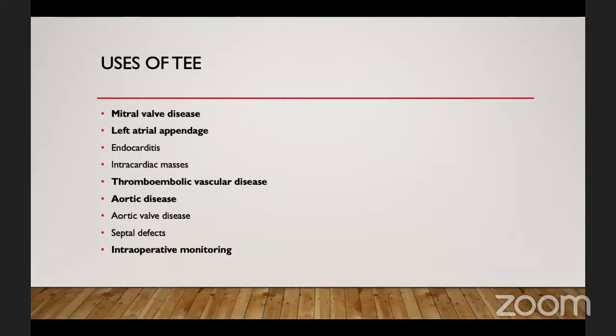Most of the time we use TEE, and an important thing for us as surgeons is that perioperative, intraoperative assessment and post-operative assessment with TEE is an essential part of our practice. Mitral valve disease: TEE is an excellent tool in assessing the exact pathology and the anatomy of the mitral valve, but specifically intraoperatively, it's less effective than transthoracic echo in assessing the severity of the gradient due to the change in the hemodynamics of the patient.